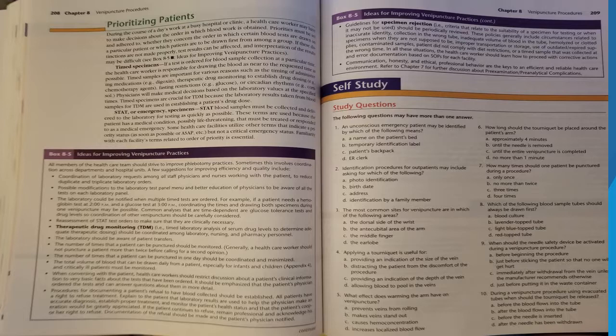Guidelines for specimen rejection, i.e., criteria that relate to the suitability of a specimen for testing or when it may not be used, should be periodically reviewed. These policies generally include circumstances related to inaccurate identity, collection in the wrong tube, inadequate volume of blood in the tube, hemolyzed or clotted specimens when they are not supposed to be, improper transportation or storage, use of outdated, expired supplies, contaminated samples, patient did not comply with diet restriction, or timed samples that were collected at the wrong time.